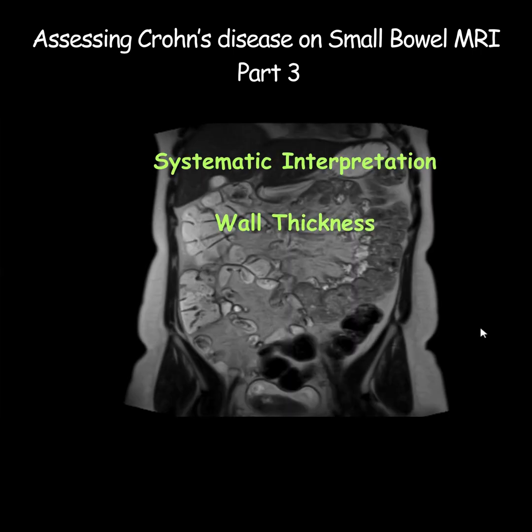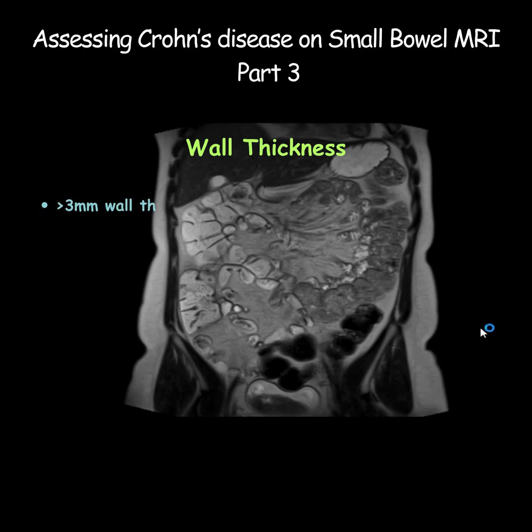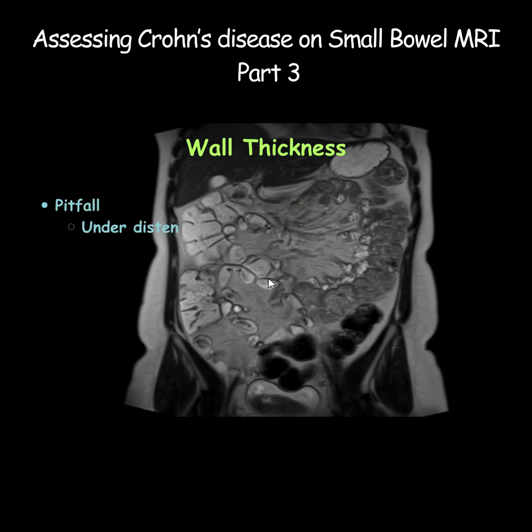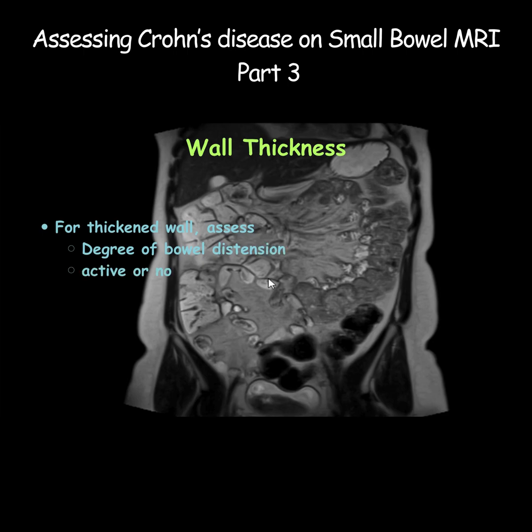Let's begin the systematic interpretation. As a rule of thumb, wall thickness over 3 mm is considered abnormal. So if you notice any area which looks abnormally thickened, just measure the thickness — if it's above 3 mm, it could be a sign of bowel wall involvement by Crohn's disease. But before calling anything abnormal, always consider the level of bowel distension, as collapsed bowel loops may appear falsely thickened. Also, a strictured segment often remains under-distended due to fibrosis in the wall. So when you see thickening above 3 mm, ask yourself: is this artifactual, or is it active inflammation or chronic fibrosis?